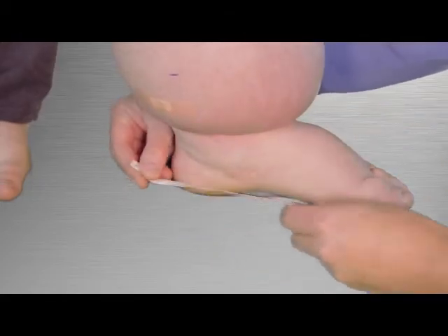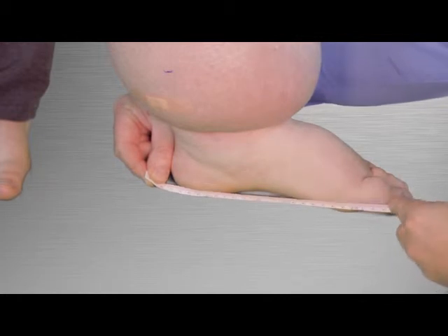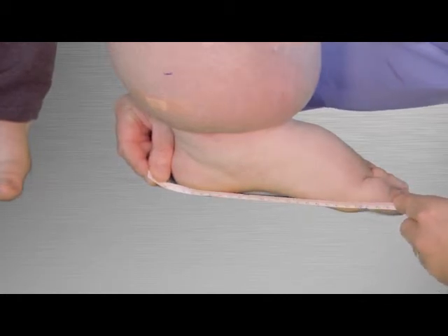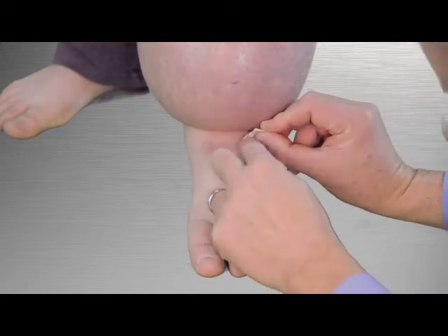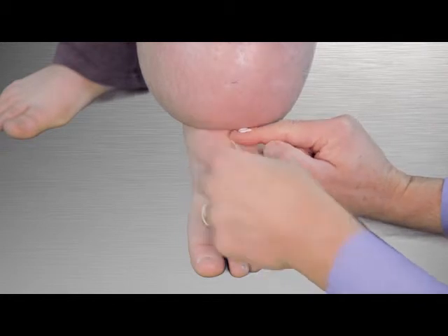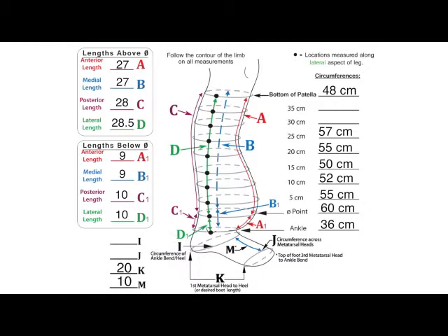Moving to the foot, position the zero of the tape measure at the back of the heel. Measure the length to the first metatarsal head or to the desired length of the boot, and record the value on line K. Measure the top of the foot from the third metatarsal head to the ankle bend and record this length on line M.